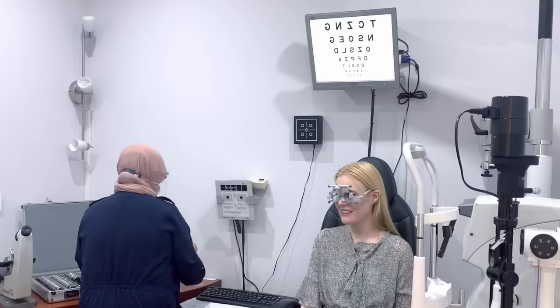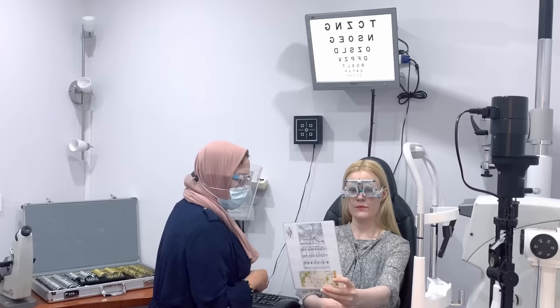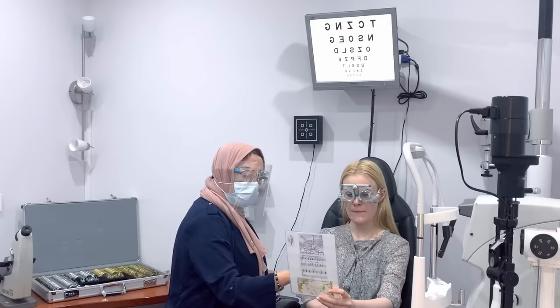So I'm going to just take that away, and then we're going to look at something for close, okay? So if you look at this reading chart, you're still able to see the bottom line there? Yep. And you know where you use your computer? How far away is your computer, would you say? About this far, yeah. So let me just take a measurement on it just to confirm. It's about 52 centimetres roughly, okay? So keeping it there, are you able to see M10? There, yes. That one there.